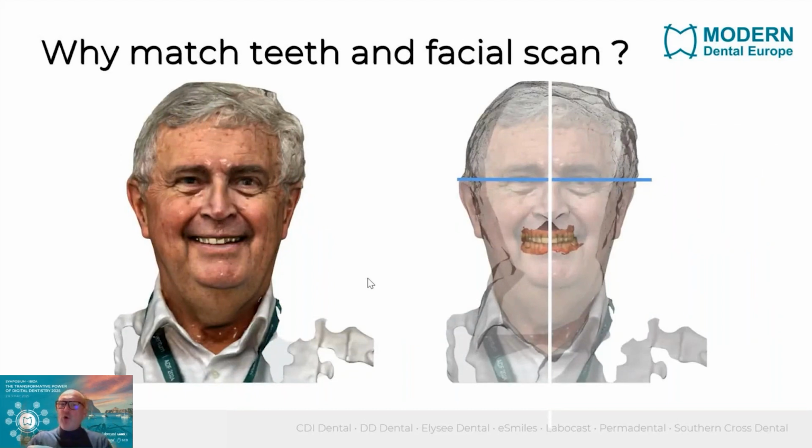Of course, the whole software as we have it, as we see it in this Rayface device, is not available. We cannot automatically align with the intraoral scans or incorporate CBCT, etc. But we can do all this in our smile design software, in the exocad Smile Creator.